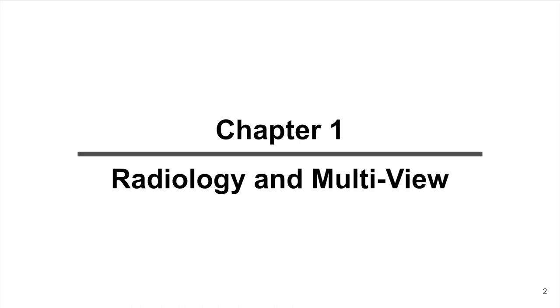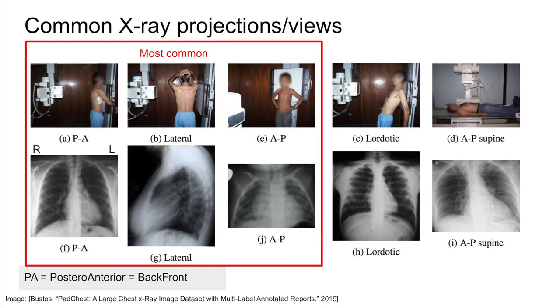This chapter will focus on imaging and radiology. Let's start by talking about the data, specifically the different projections, also known as views, of chest x-rays. The process of taking an x-ray depends on what clinical questions are being asked and what is visible in that projection to answer that question.